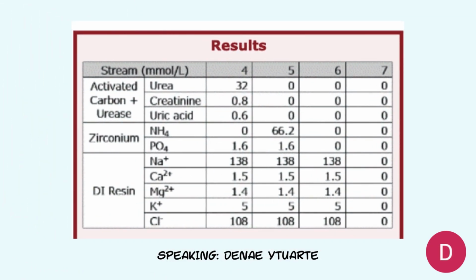Next, we'll be looking at the results. Spent dialysate contains various toxins. Our system, based on extensive modeling, has the potential to remove nearly 100% of these targeted contaminants. While existing research supports the absorption capabilities of our chosen materials, further experimentation will be necessary to confirm actual removal percentages and any kinetic factors influencing the process.